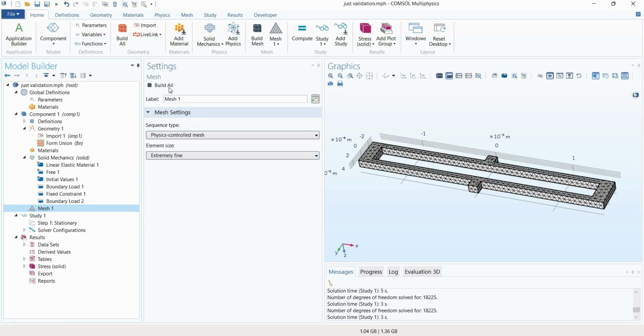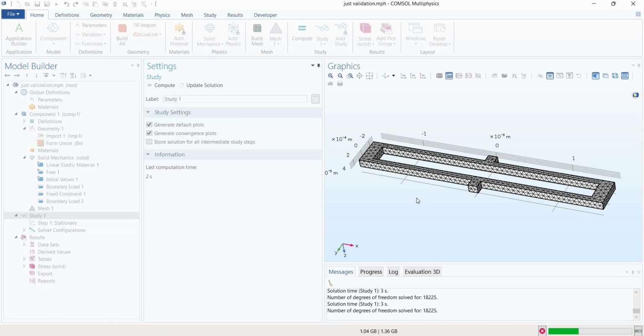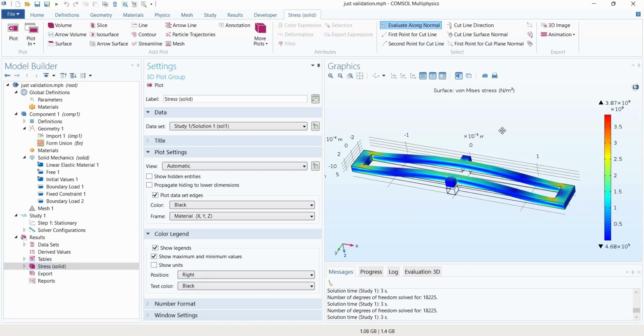And for computing the result, just click on compute. So this is the von Mises stress for 14 atm pressure.